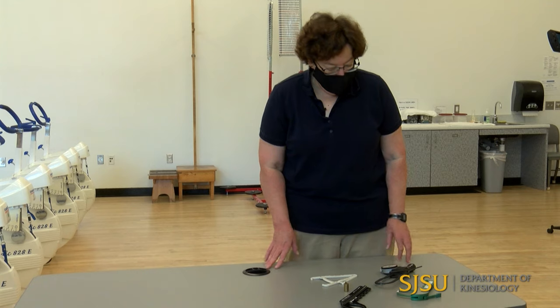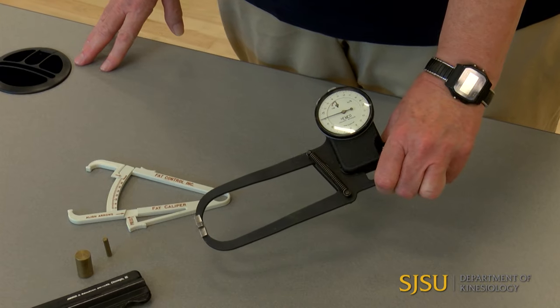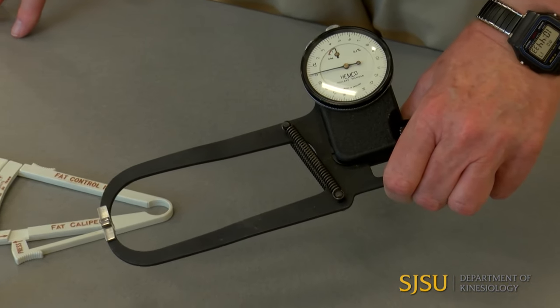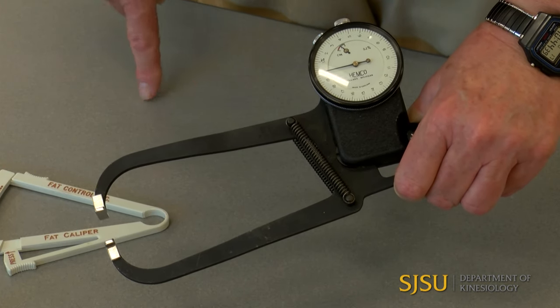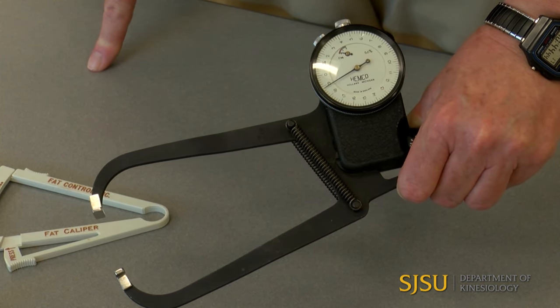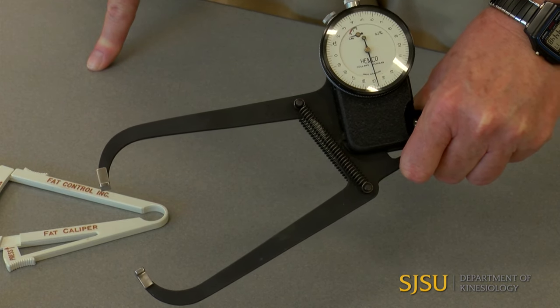We're going to demonstrate how to take skinfold measurements and show some different calipers. The Harpenden caliper is a very high quality, research-grade caliper, a little bit harder to use. As you move it, it will go around to 20 millimeters — we measure skinfolds in millimeters. When you go around again, the little dial inside shows you're between 20 and 40, and then again up to about 55 or so.